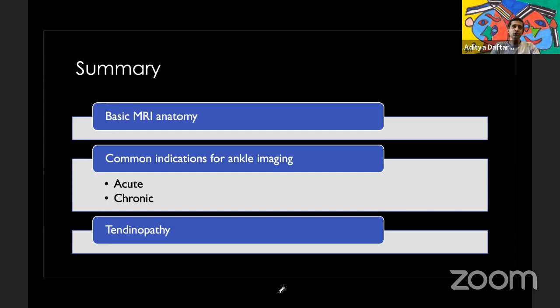On the other hand, patients with chronic instability and chronic pain who come in, we're trying to determine if there is instability, what is the status of the ligaments, how well or poorly have they remodeled, what is the status of the articular cartilage, because if there's bad articular cartilage, then we're really not doing much of a favor to helping this person, or at least we can decide on what the prognosis for these patients would be once we do go ahead and fix the ligaments. And then we've talked about the fact of instability leading to micromobility, and micromobility promoting anterolateral, anteromedial, and posterior impingement. So we talked a little bit about that as well.